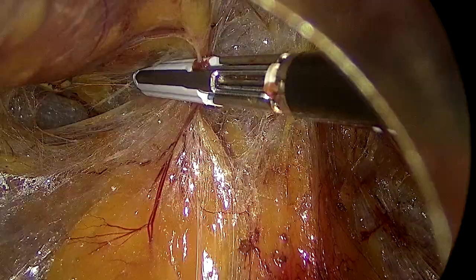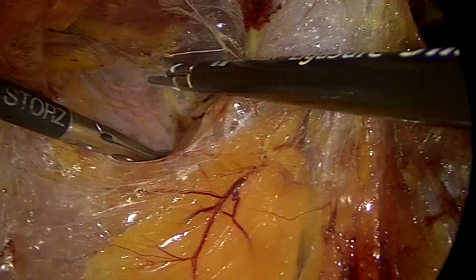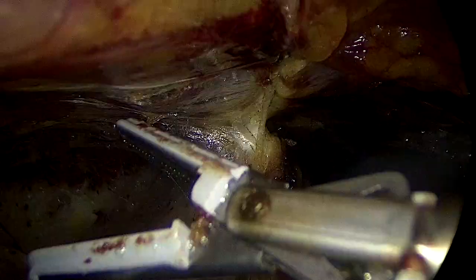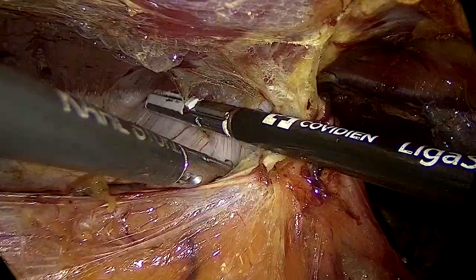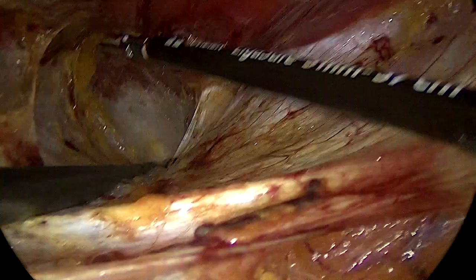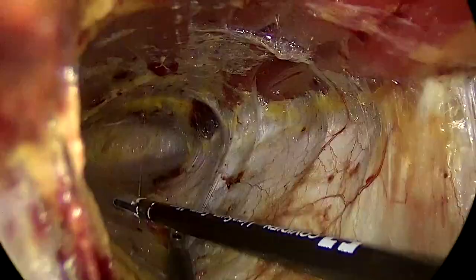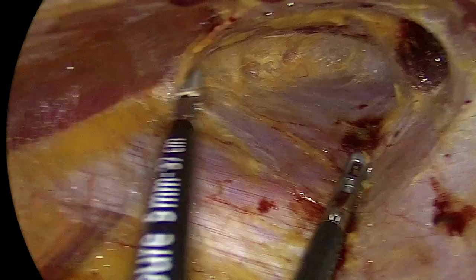Then we turn our attention to the right retrorectus space, making sure we're really hugging the right rectus, because there is a chance you may go behind the posterior rectus sheath into the peritoneal cavity, creating an accidental pneumoperitoneum. To find your posterior rectus sheath on the right retrorectus, stay very close to the rectus and do the dissection making sure there's not a lot of blood in your surgical field. I always use energy when dissecting towards the midline, and try not to use energy when dissecting towards the linea semilunaris, because that is where my neurovascular bundles are. I know I've worked high enough once I start to see the transversus muscle on the screen.